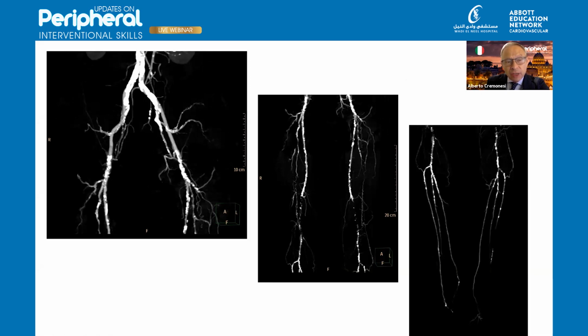Also, the contralateral approach in crossover, I think we will see from the direct angio, but I don't think this is accessible with a contralateral crossover technique. When we started the procedure, just having a look at the contralateral common femoral artery with the duplex scanner or ultrasound, it looks quite heavily calcified. So we were not happy to go contralateral because of the heavy calcium load in the contralateral common femoral. I fully agree with you. So from this perspective, we cannot use the contralateral or the ipsilateral antegrade puncture.